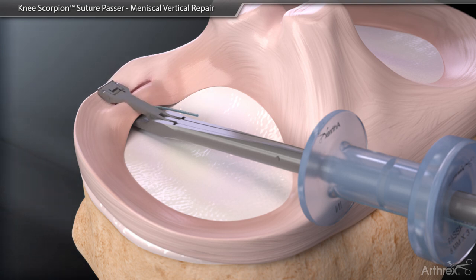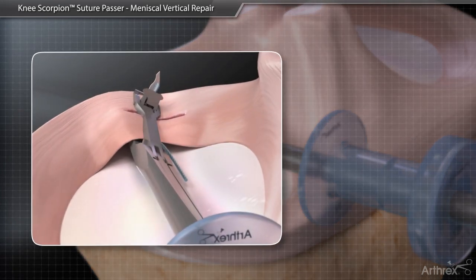Gently close the jaws to secure the tissue, then advance the scorpion needle to pass the suture through the tissue. The suture will be captured in the top jaw. Passing suture in tight areas may require slight rotation of the Knee Scorpion to allow the needle to exit into the intercondylar notch to avoid hitting the articular surface of the condyle.